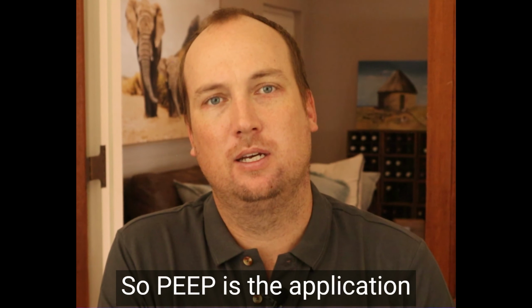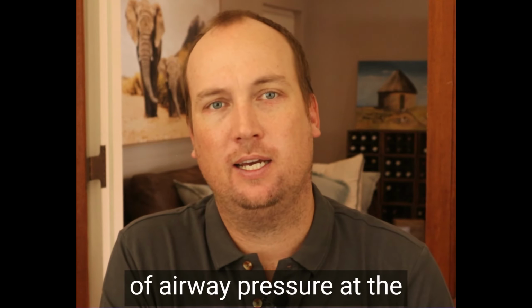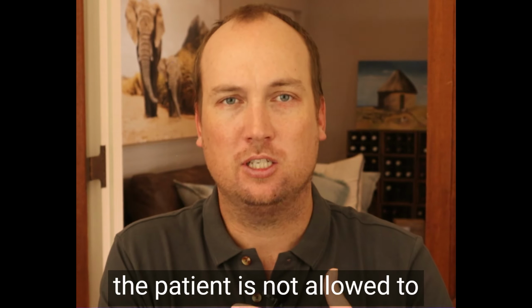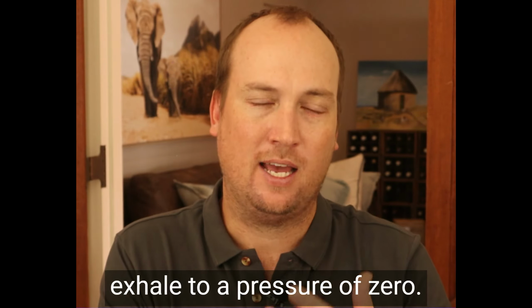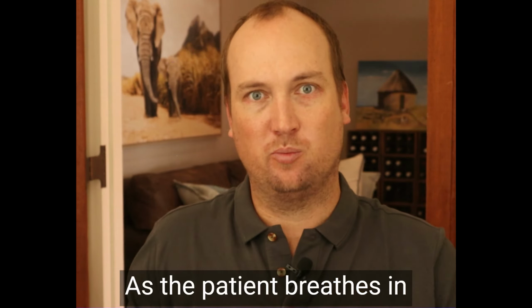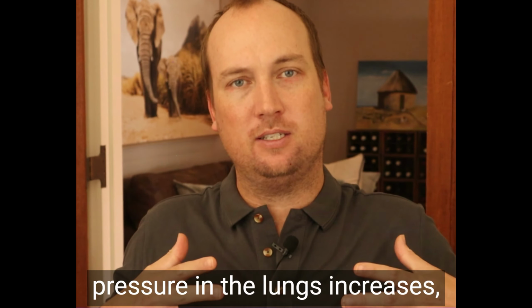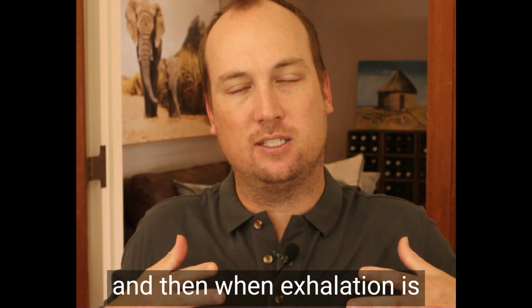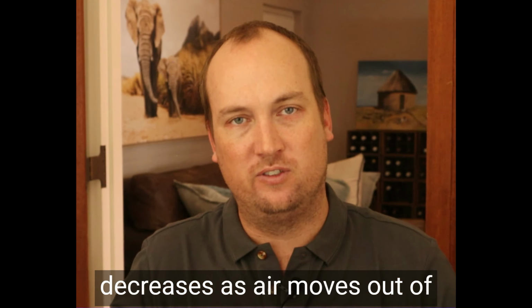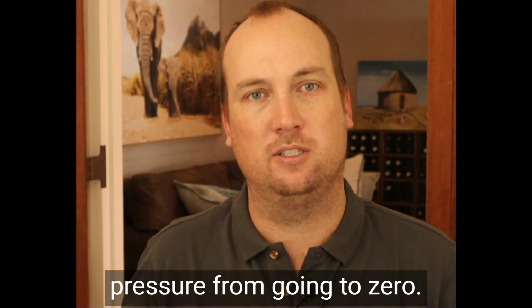So PEEP is the application of airway pressure at the end of exhalation so that the patient is not allowed to exhale to a pressure of 0. As the patient breathes in under positive pressure, the pressure in the lungs increases. And then when exhalation is allowed, that pressure now decreases as air moves out of the lungs, but PEEP prevents that pressure from going to zero.